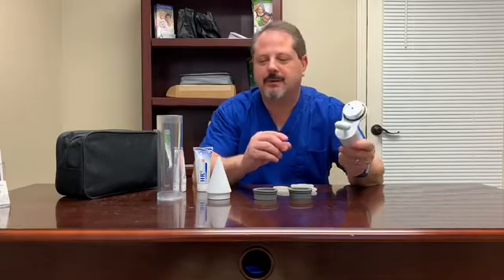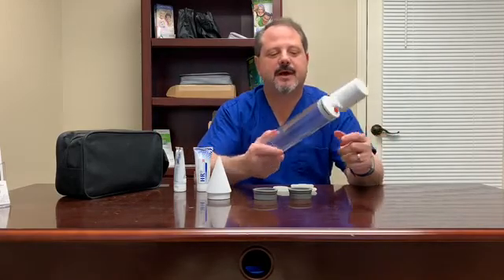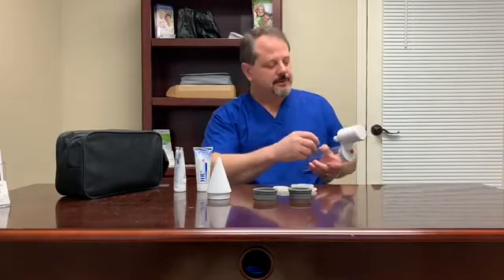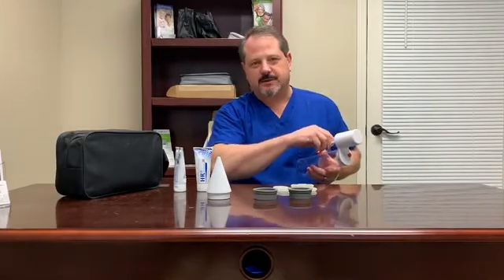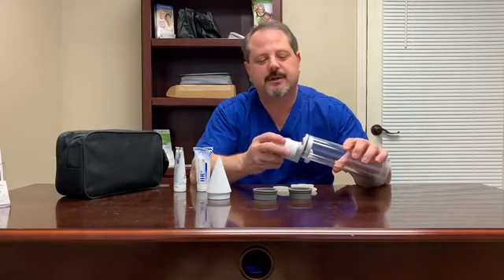The way the manual pump works is it just tightens down, screws down onto the end of the cylinder, and then when you hold it to apply pressure you just pump it by gently moving that lever just like that. It'll create an abundance of pressure that you'll need to get the job done.